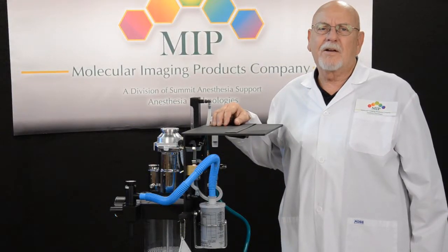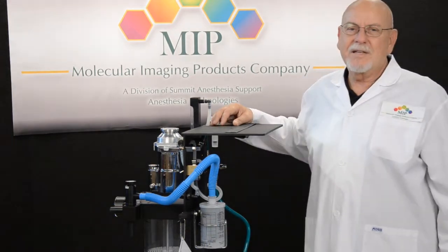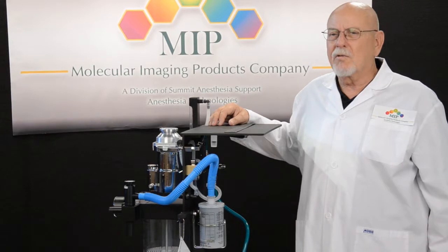My name is Jim Houts. I'm with Molecular Imaging Products in Bend, Oregon. I'd like to address an issue that we see frequently out in the field with respect to the activated charcoal filters.